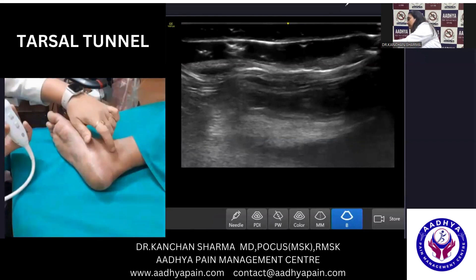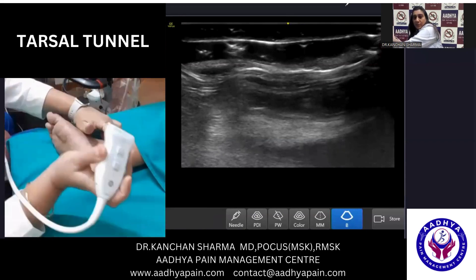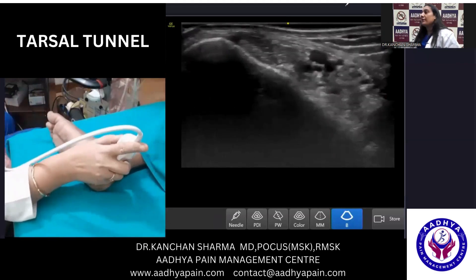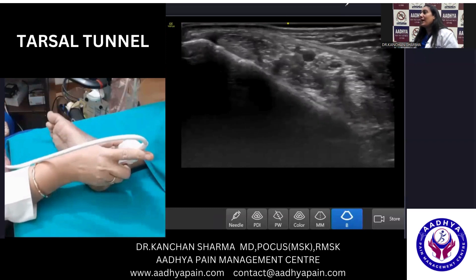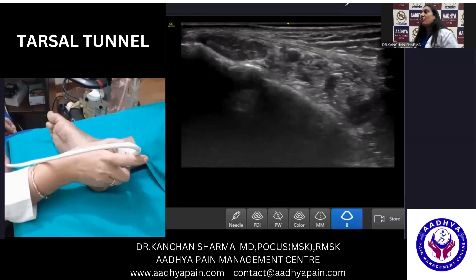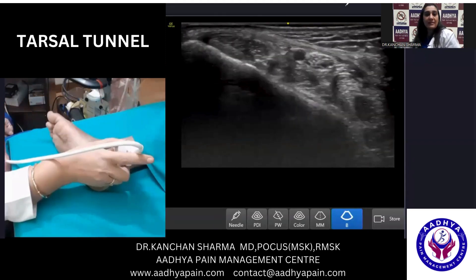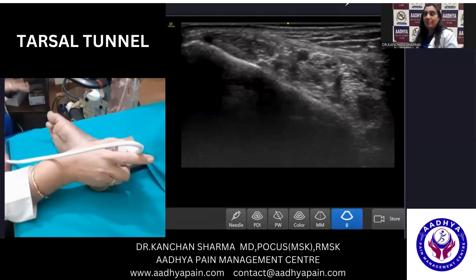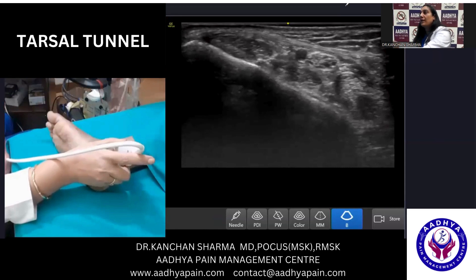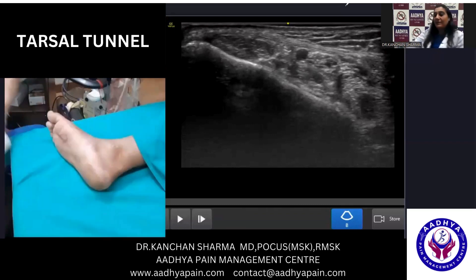This is your medial malleolus — the posterior portion of it. I am just putting one finger there, and then keeping the probe in the short axis with the aspect marker just over it. I'll just try to angulate my probe in such a manner that I'm able to see all the tendons lying very nicely. I'm going to make use of anisotropy — the tendons are the ones that exhibit maximum anisotropy. So initially, when you're keeping the probe and you are not sure which tendon you are looking at, always make use of the anisotropy; that will surely help you to identify the tendons very nicely.